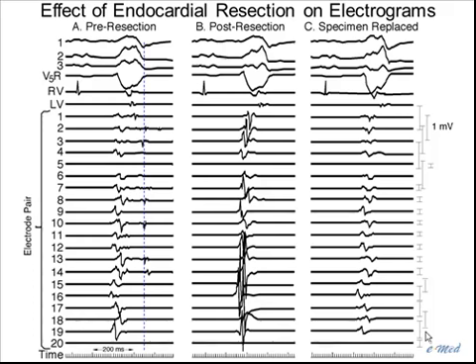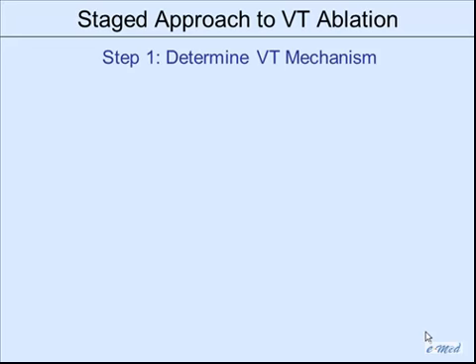Well, did the electrode array move? Are we recording a different site? No. We put the specimen back in place and record through it. And so these electrograms are the same as these. It's just, in essence, filtered by the scar, muted. So these become far field, and that's what we see during systole in these cases. And of course, the late potentials are still gone.